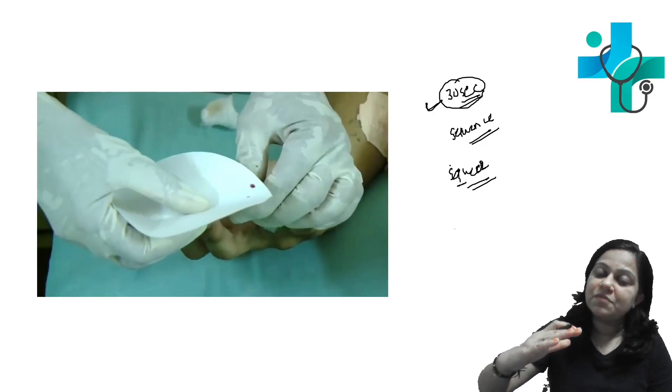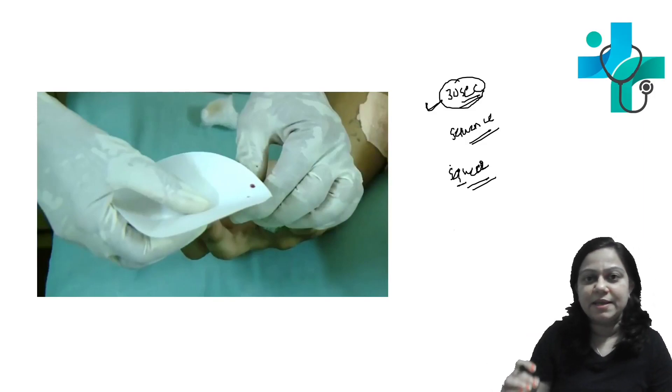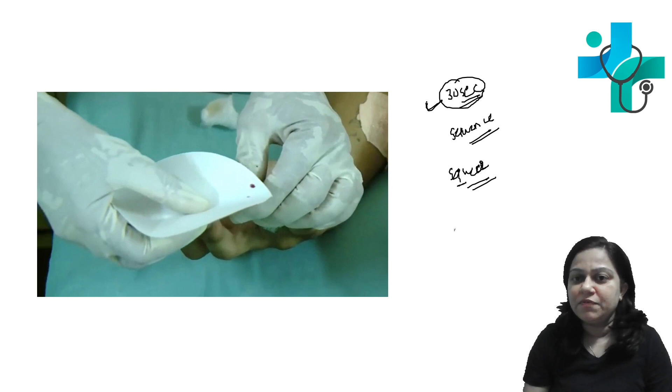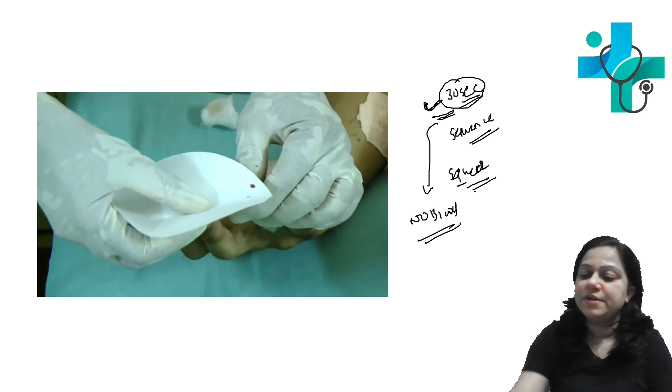Do not press the filter paper at the pricking side. You have to apply the filter paper every 30 seconds until no blood appears on the filter paper.